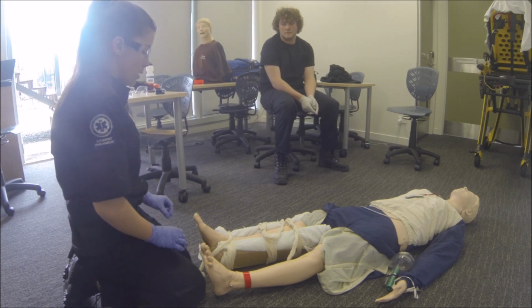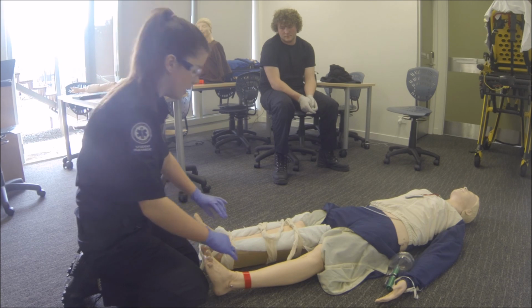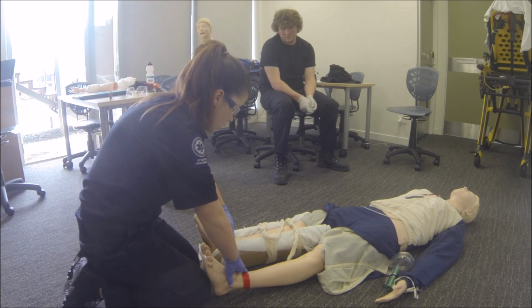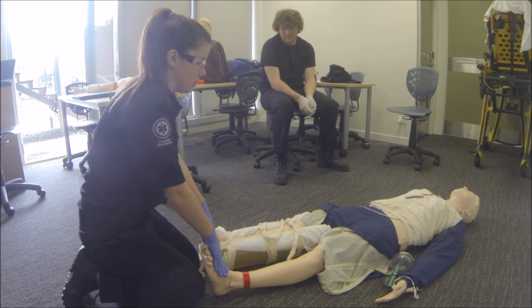Now that the splint is on, I'm just going to recheck his cardiovascular and neurological integrity. So the cap refill, which is coming back fine, the pulse, which is coming back regular and same strength. So if you can wiggle your toes for me again. Yep. Great, and they're still about the same temperature also.